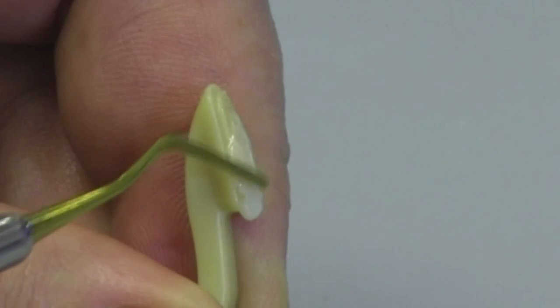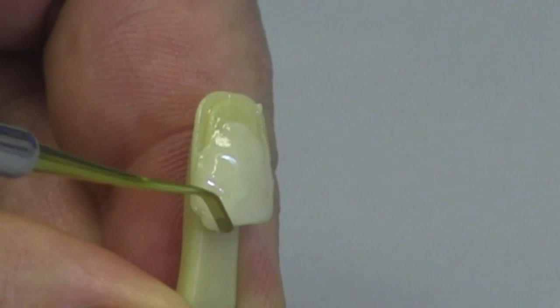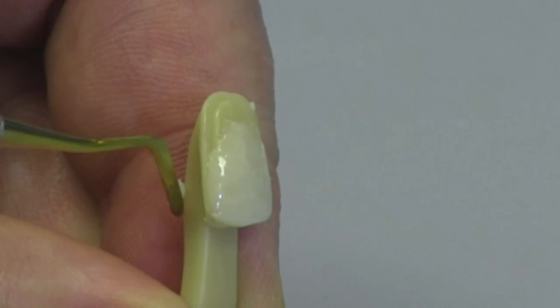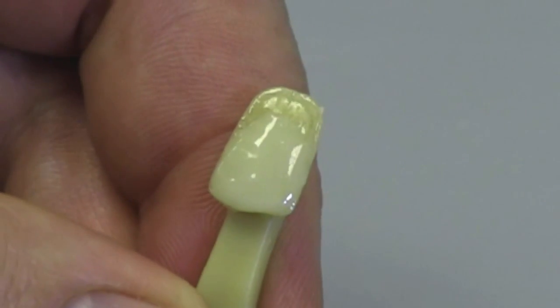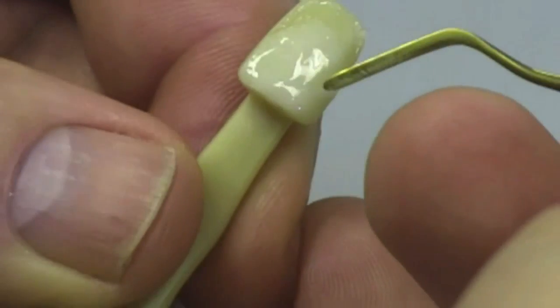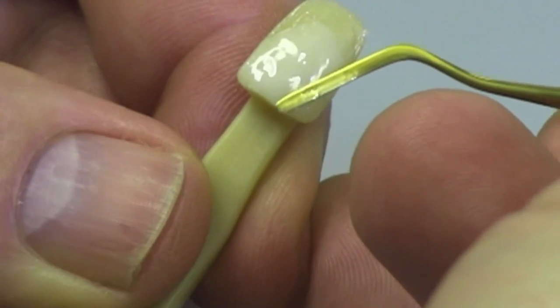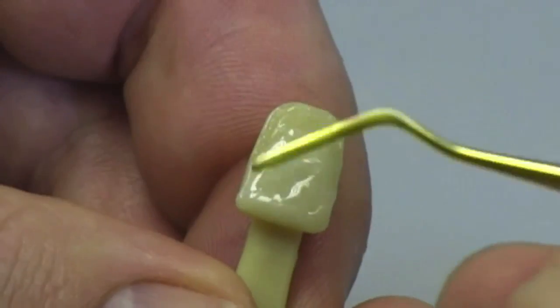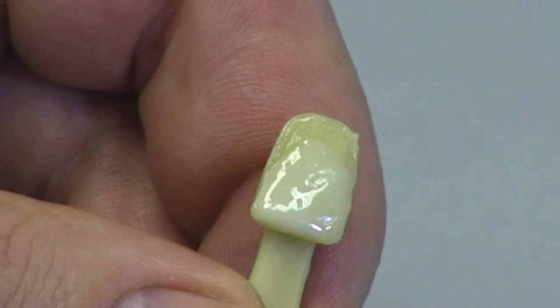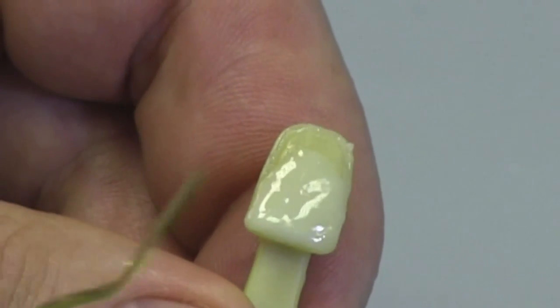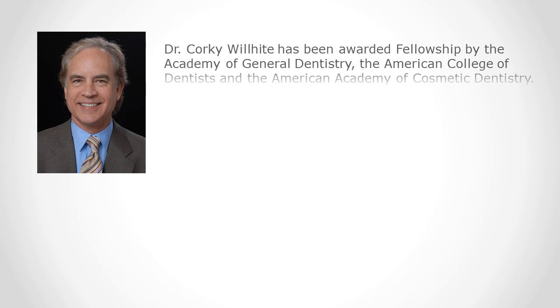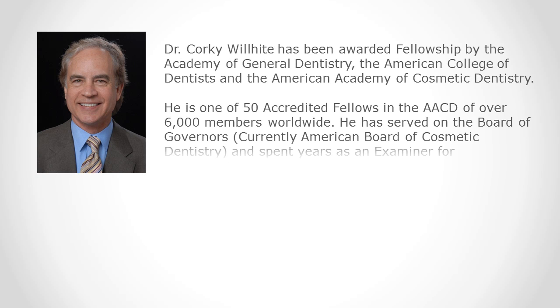The same thing would be done in terms of handling or eliminating white lines is I don't want that material as I pull it over onto tooth structure to be able to really tell where the composite stops and the tooth structure starts. I want to blend that carefully until the margin becomes invisible. So again, you can see an overall relatively smooth surface that would have very little chance of having air bubbles or creating a white line.